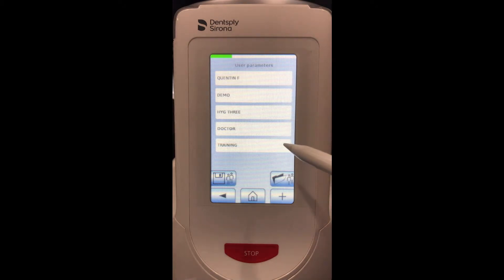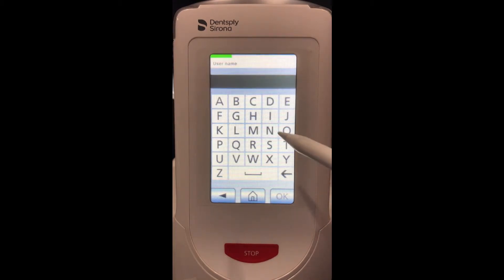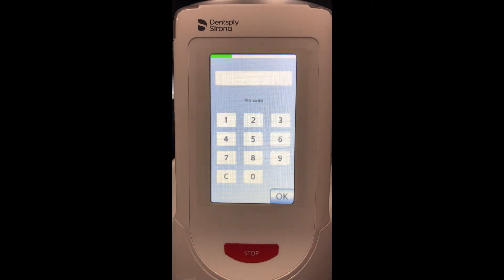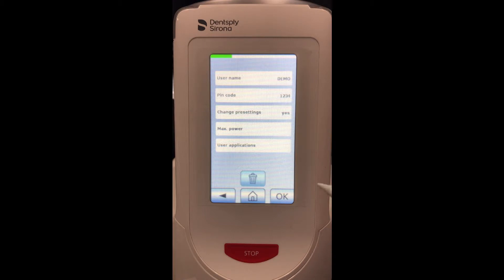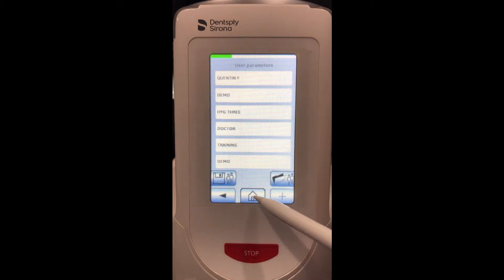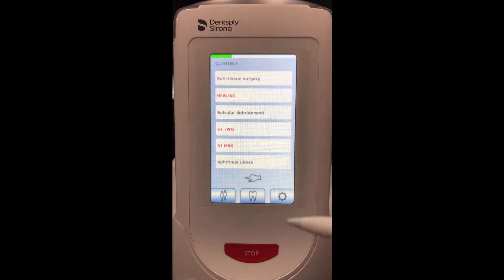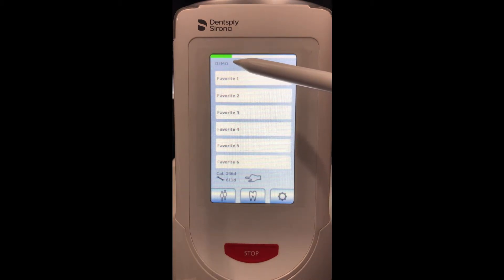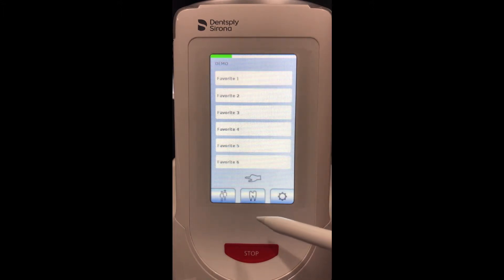We would click here. Let's remove this user so we can add a new one. We have the ability to have six users on this laser. To add one we click the plus, give the username whatever we'd like — I'll call it 'demo' — then set a pin code. No two users can use the same pin code, so let's use 1-2-3-4. Click OK. Now let's go to the home screen; if we want to switch to the new profile we click the bottom left corner, enter that pin code, and now we are under the demo profile.